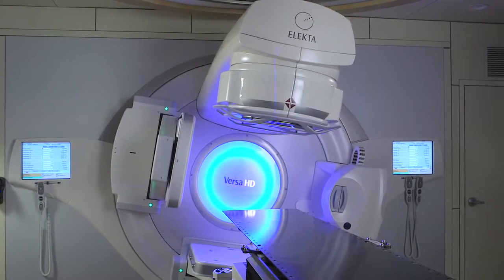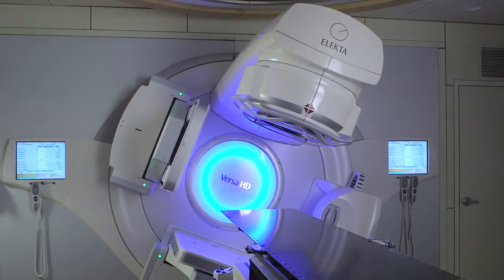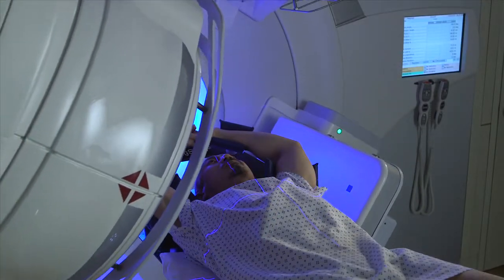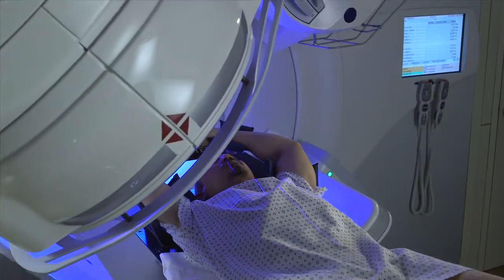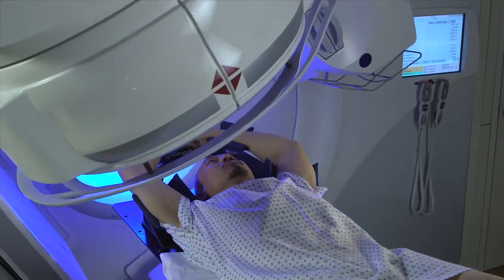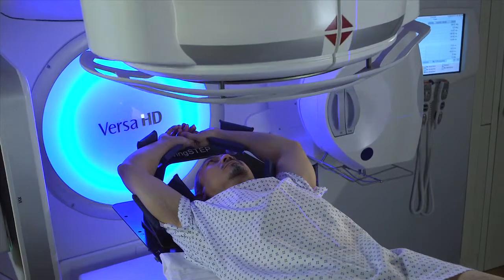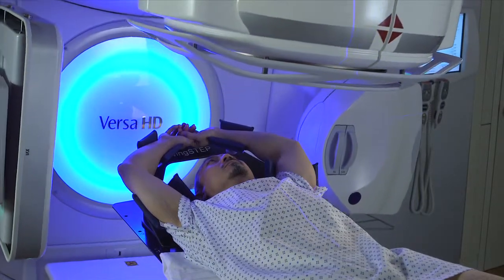With its smooth, curved lines and soft lights, VersaHD was designed with patient comfort in mind. As treatment begins, you may hear some clicking and humming sounds or sense some movement, but the machine doesn't touch you, and the radiation is invisible and painless.